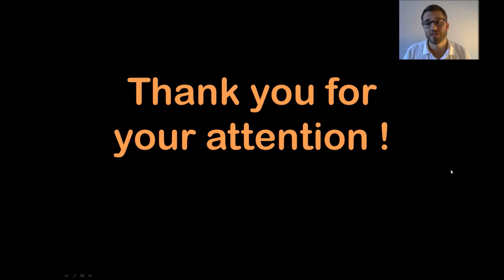Well, thank you for your attention. That was part 2 of the why is this patient coughing clinical case, and I just wanted to show you all these secondary findings because it's rare that we have such a complex patient with so many pathological findings, and I wanted to share all these things with you.